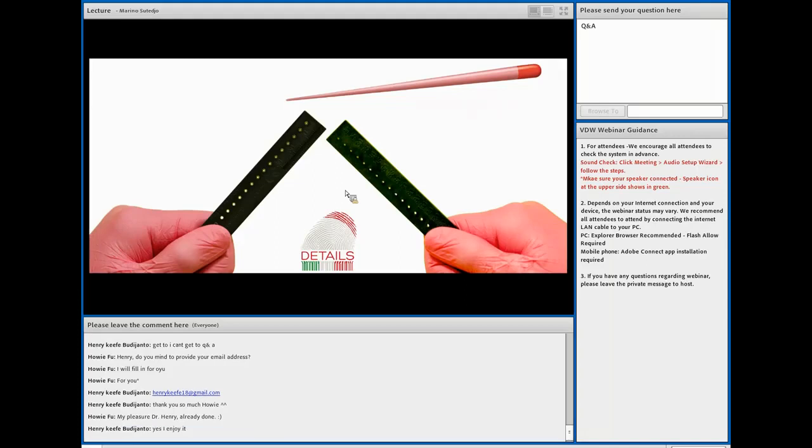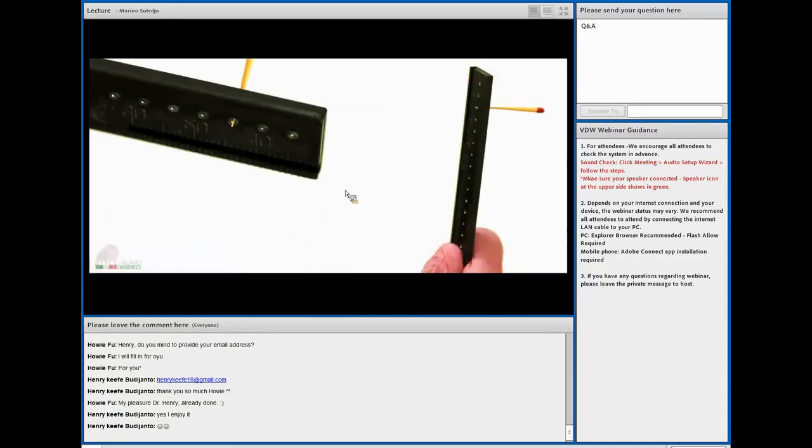So once I take my gutta percha 4% taper, I take 25, I put it on my working length and I check. If I don't have a good enough apical stop with my 25/04 taper of gutta percha inside my 25/06 instrumentation, then I'm going to resize my gutta percha to one size larger. In this case, it's number 30.